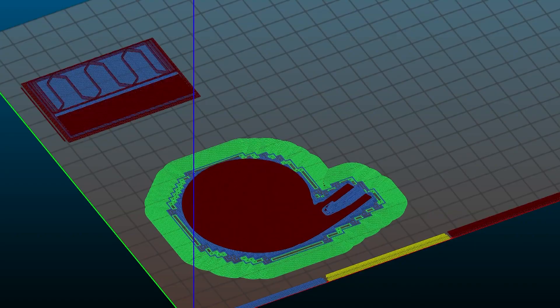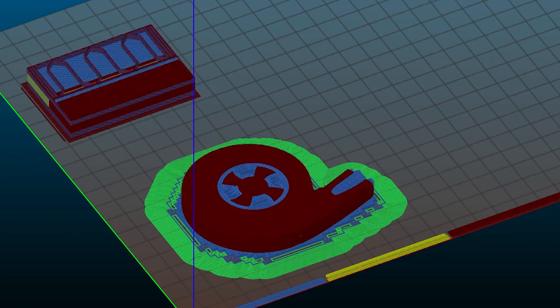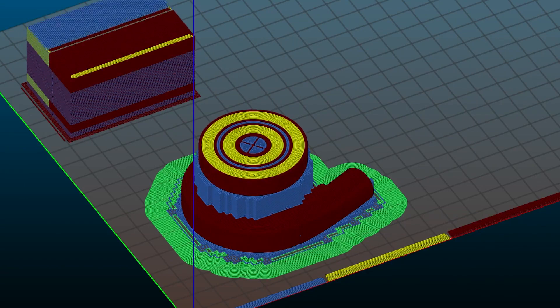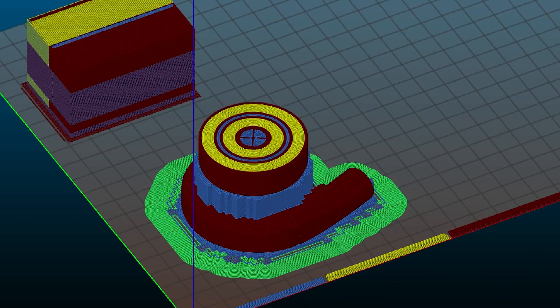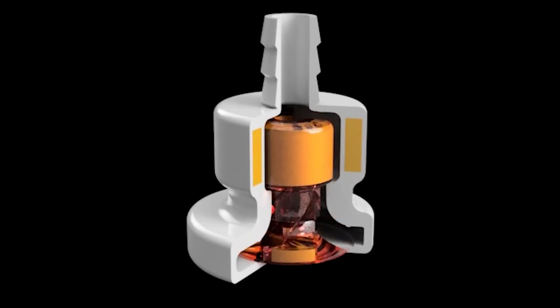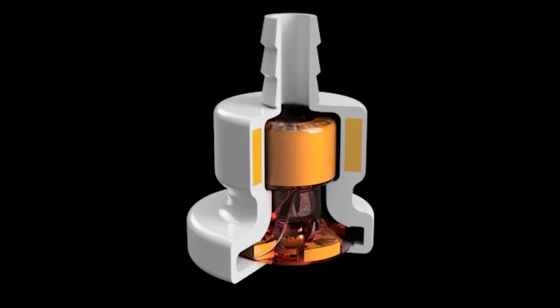Using this new process, we printed a pump demonstrator in one single print job. It has 10 integrated components: the housing, the impeller, four magnets for two radial magnetic bearings, and four magnets fitted into the blade shape for driving the impeller by magnetic coupling.